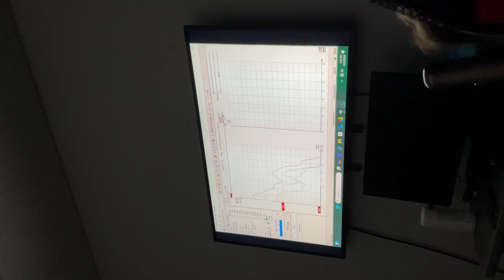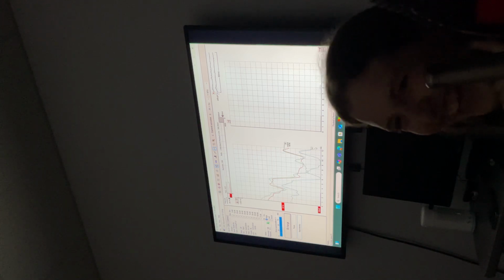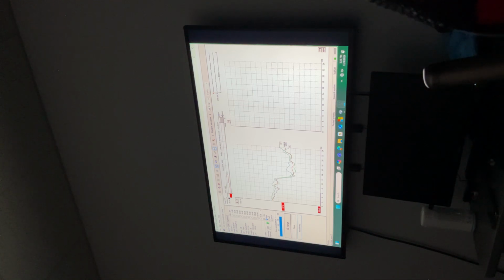Good start. So let's. Do you see a wave 5? I don't know. See now, I need a response from you. Do you see a wave 5? Is it that right there? So this is too far. No, it's too far. That's what I was gonna say.